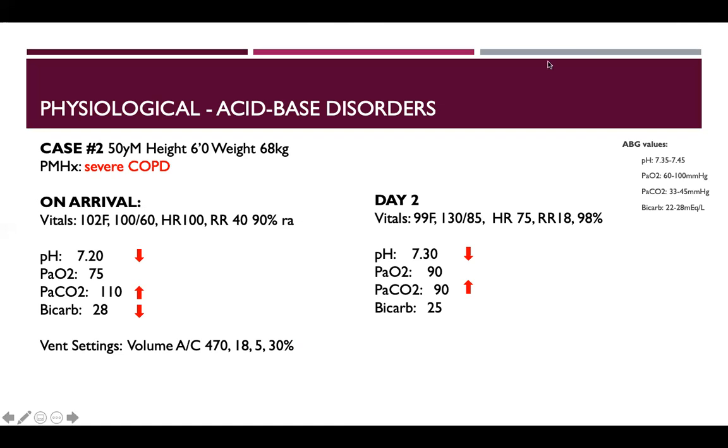Yeah. That comes really into view when you're trying to wean a patient with advanced COPD who, for whatever reason, got intubated. Ideally, this patient should not be intubated. You should try to do everything in your power to avoid intubating COPD patients because they generally don't do well. Same with asthma patients on ventilators. About 20 or 30 years ago, every single one of them would get intubated, and a lot of them would be harmed by the critical care that we so tried to provide. Nowadays, non-invasive is the name of the game, and we use that very liberally and extensively.